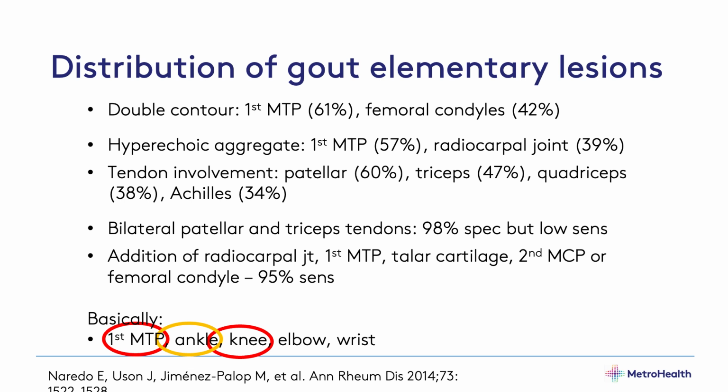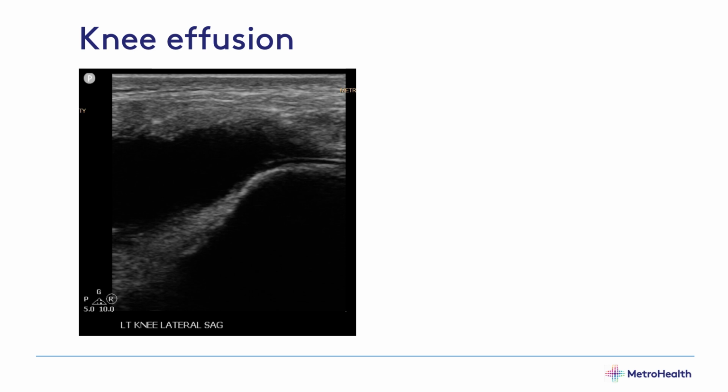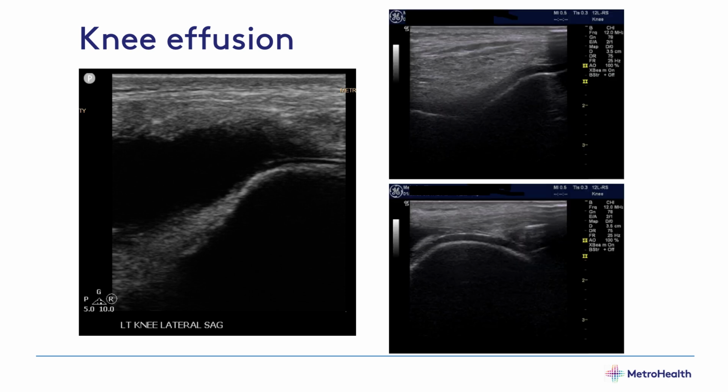So here are some cases that I'll show you. To start off with, this is the case that was done in the ED. You guys did it. He came in with a swollen knee, and you guys did the ultrasound and showed a big effusion, and it was tapped, and it showed uric crystals. What was not commented on, I don't think, was this line here that intrigued me. So when he came to see us for follow-up and his joint was better, I still went ahead and looked.